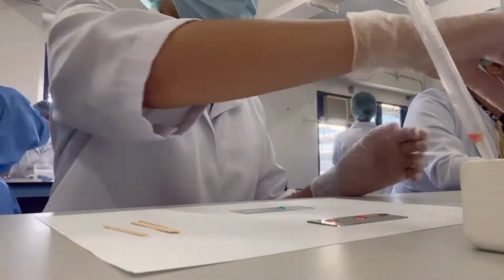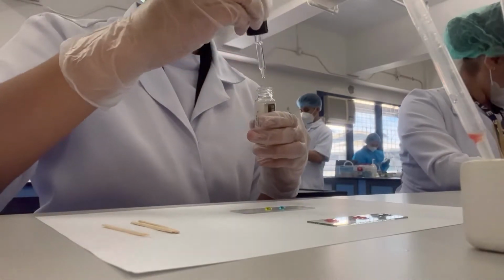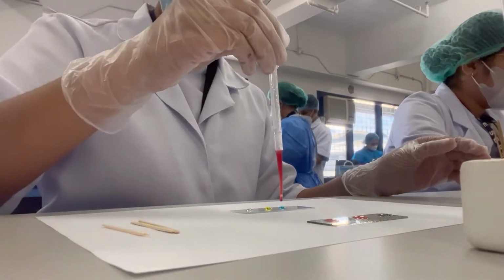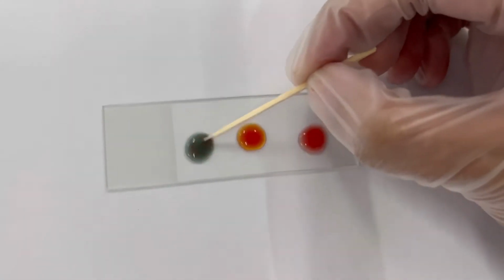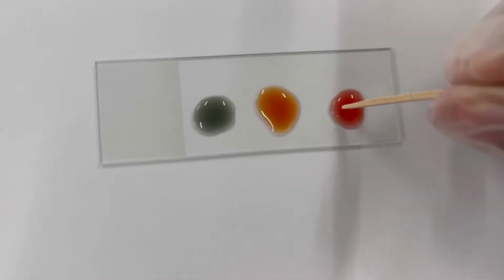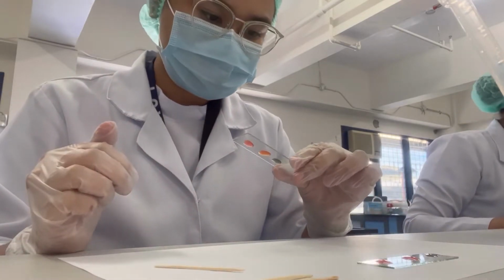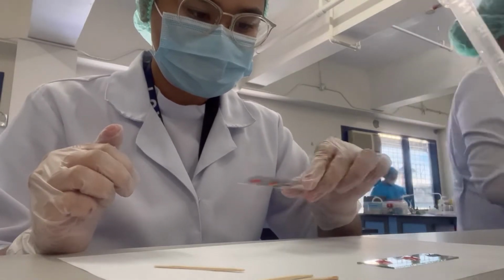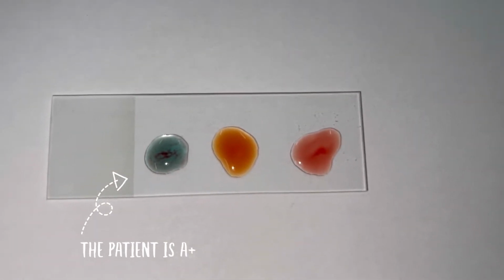Place 1 drop of anti-A, anti-B, and anti-D on a clean slide. Then, add to each drop of reagent 1 drop of red cell suspension. Then mix it using an applicator stick. Gently tilt the slide from side to side continuously for up to 2 minutes. Lastly, read, interpret, and record the result.